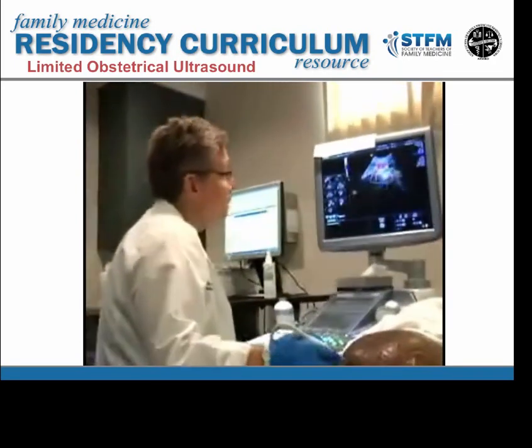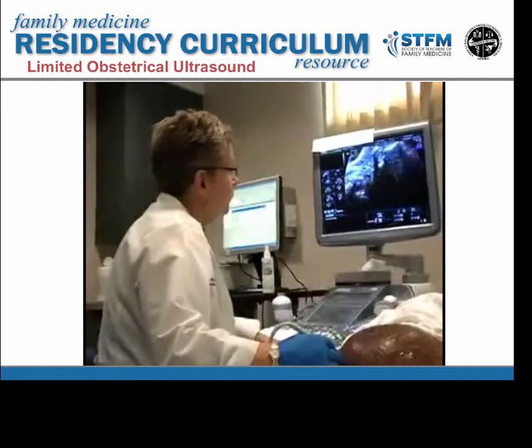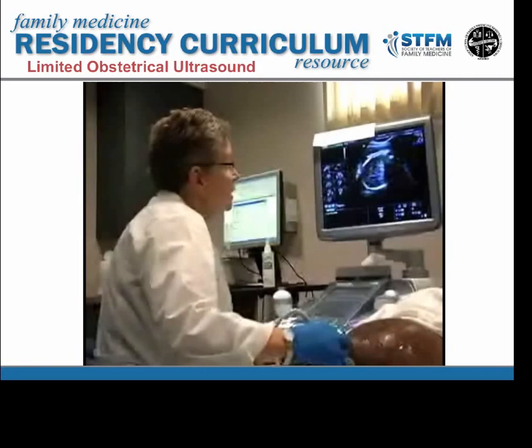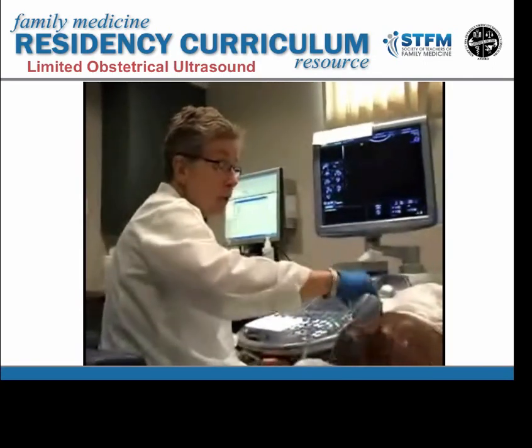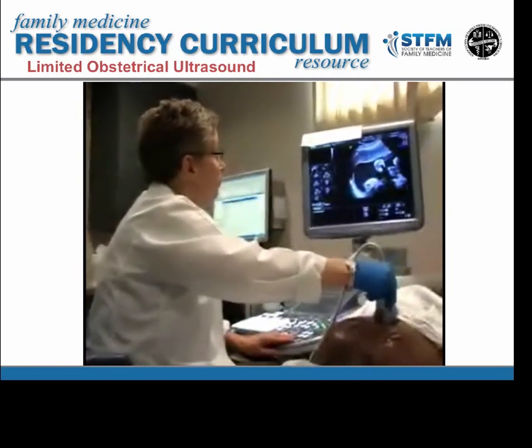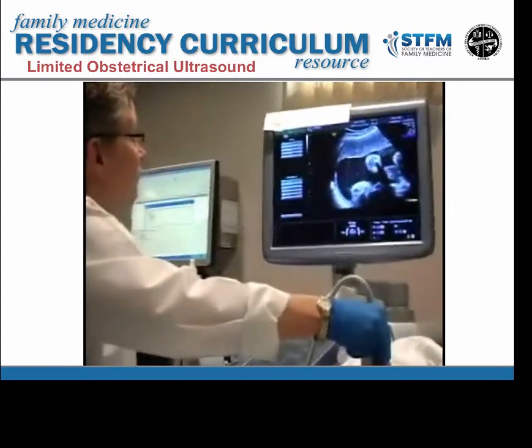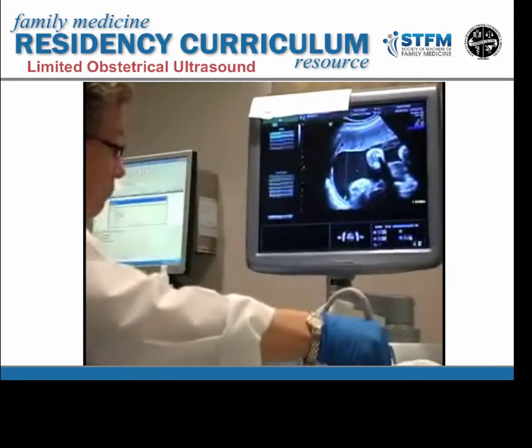So the total amniotic fluid index is done by adding together the pockets from each of 4 quadrants. In the case of pregnancies that are less than 24 weeks, most of the uterus is below the umbilicus, so there are not 4 quadrants. So in that case, we would just measure a maximum vertical pocket. For example, right here, we might say the maximum vertical pocket in this case, if that's all we were measuring, would be about 7 centimeters. And that's it.